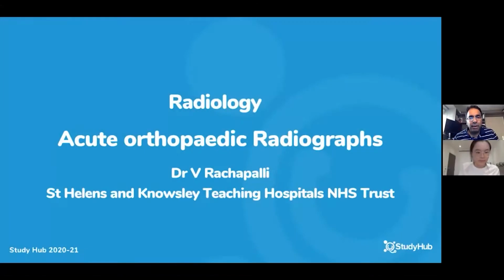So, the purpose of today's lecture is to look at acute orthopedic radiographs. What I'm trying to achieve here is not to teach you how to diagnose degenerative changes and various endocrine disorders which can affect the bone, but straightforward fractures that you will tend to see in your day-to-day life, and also to develop an approach for yourself on how to approach any radiograph that you may encounter in your career.